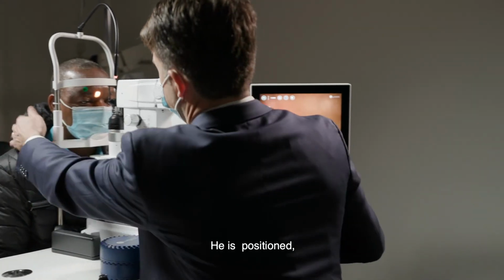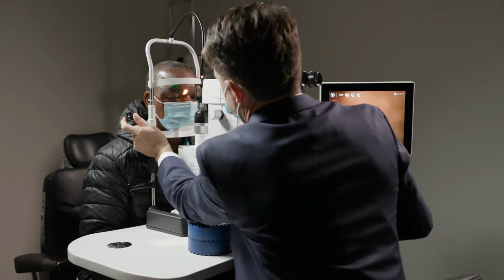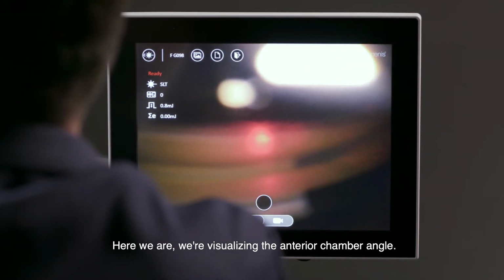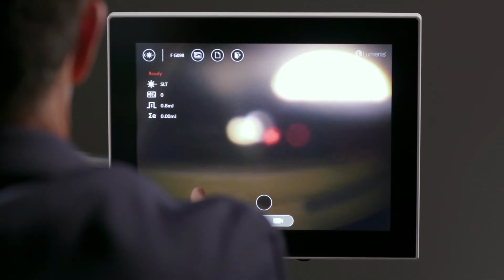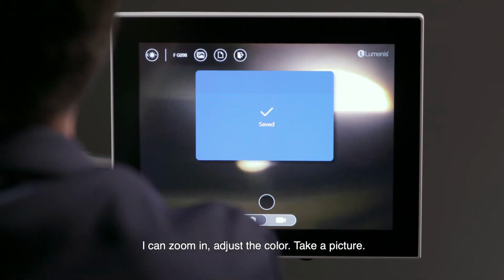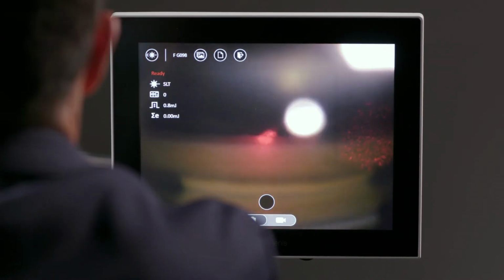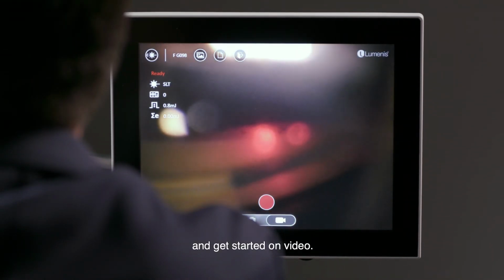So he's positioned. Putting my lens on our patient. And here we are, we're visualizing the anterior chamber angle. Now I could stop, take a picture. I can zoom in, adjust the color, take a picture. I can also do that here at the laser. Take a picture. And what I'm going to do now is switch over to video mode and get started on video.